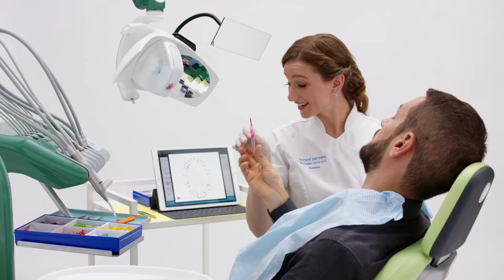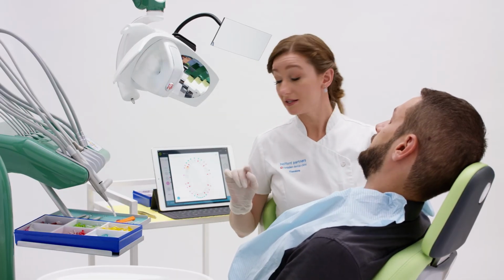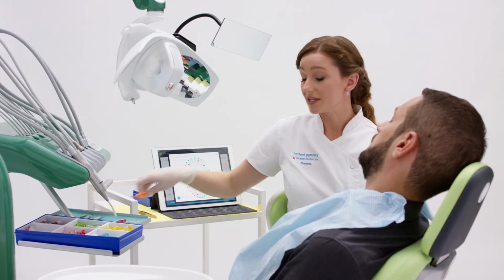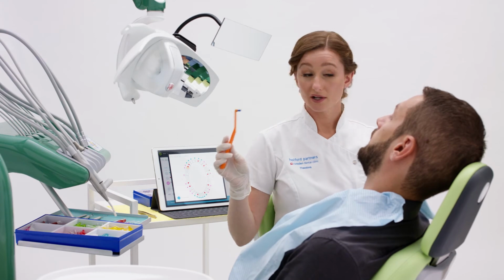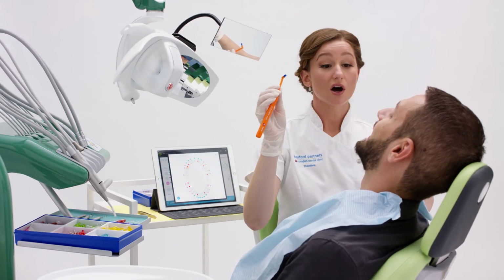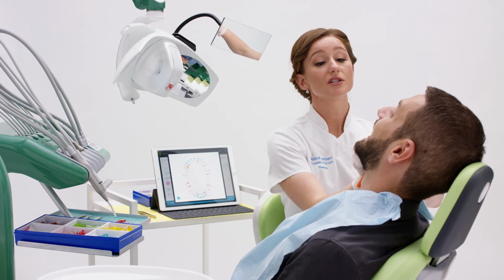The last dental aid Edward requires is the single tufted brush in the upper right sextant. Edward has a large interdental space here, so I demonstrate the use of a single tufted brush. This is shown as a grey circle on the mouth map.